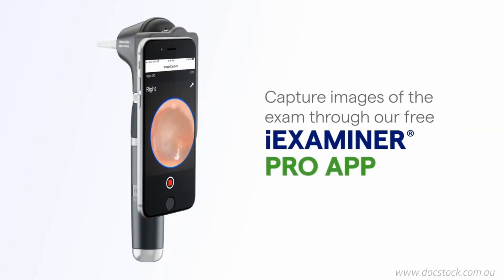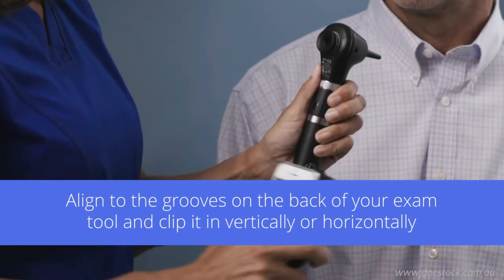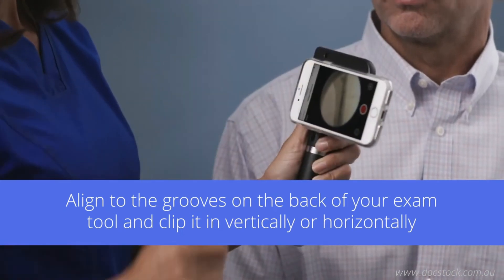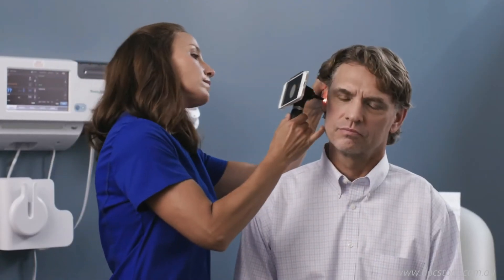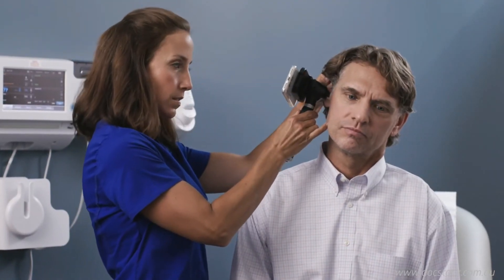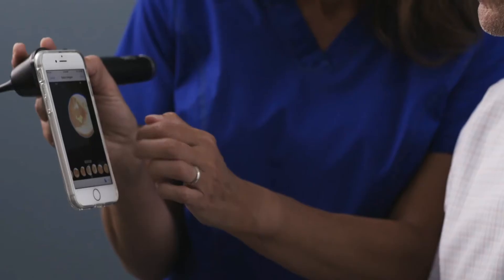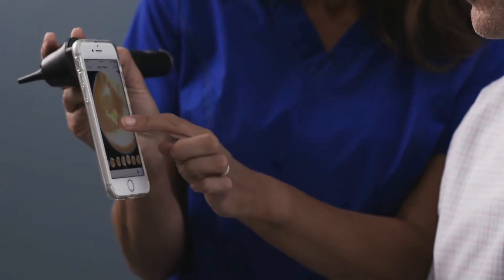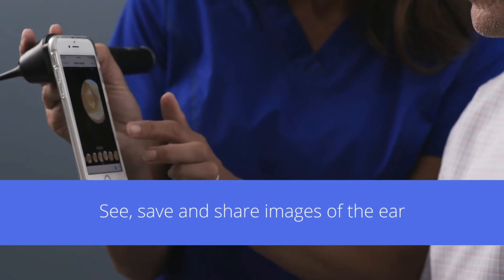You can now capture digital images of the ear exam using our macro view plus and our Welsh Allen eye examiner smart bracket coupled with your smart device. With your smart device attached to your smart bracket, aligned to the grooves on the back of your exam tool, clip it in vertically or horizontally. Follow the same steps as you would with an optical exam, guiding the otoscope into the patient's ear. Capture moments of the exam, then scroll through and find the best images to review and share for consultation and patient education.